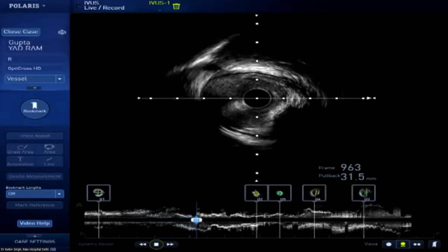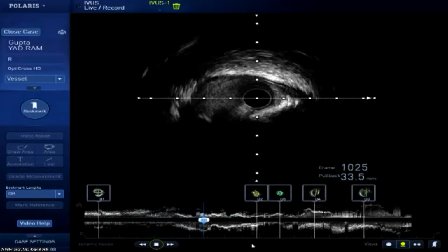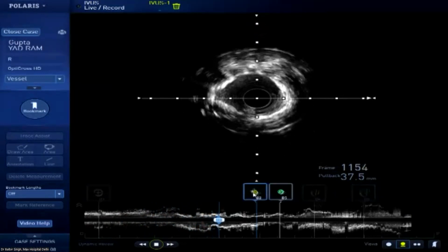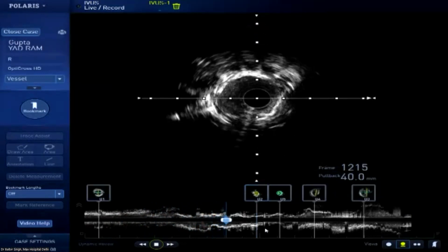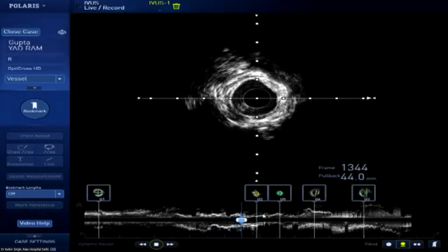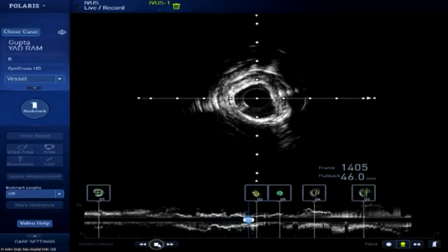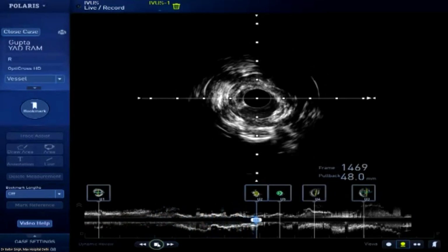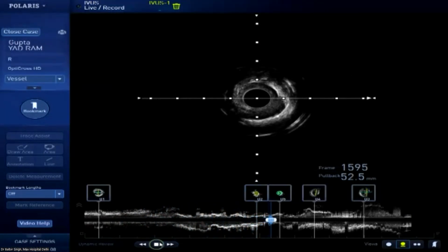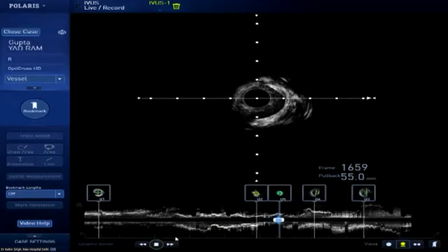Meanwhile the patient was stable, right? Immediately after this, we saw the QRS broadening. Fortunately, no hypotension, but marked ST elevation. So we had to quickly stent the left main. So you're right, imaging can take a toll. So doing two imaging runs, his ST rose up significantly. And we had to quickly stent the left main, which we'll show you.